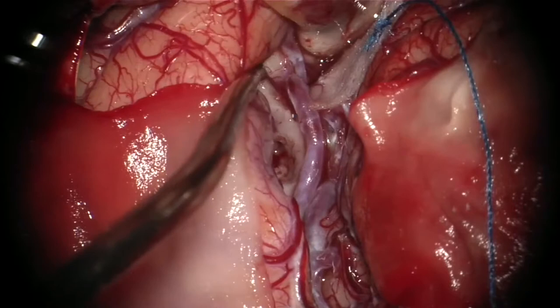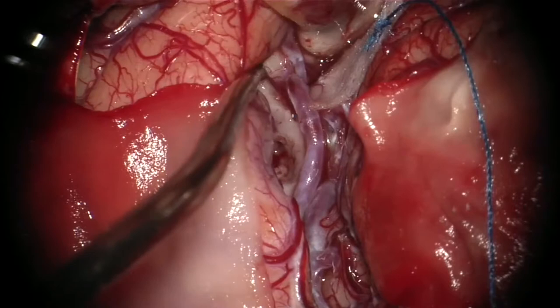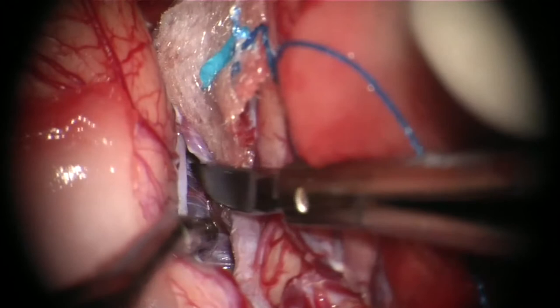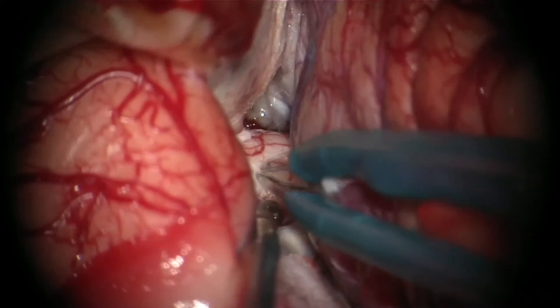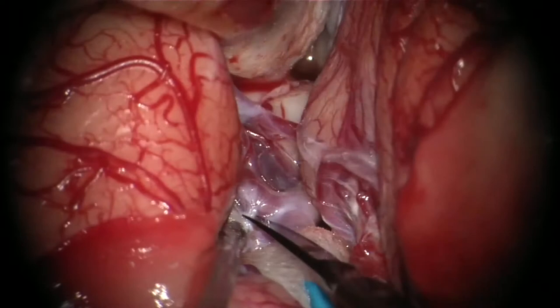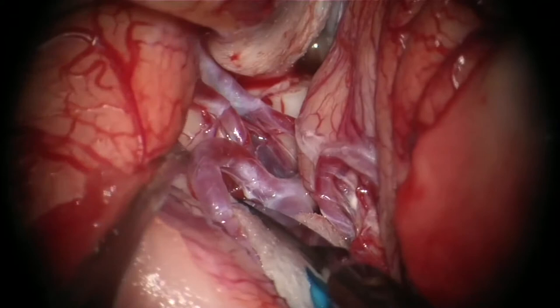These are the first pieces that we take for biopsy. And you can see here nicely the location of the anterior aspect of the uncus. I have to continue dissecting these MCA branches. I want to identify the lenticulostriates which go to the anterior perforated substance. This is a key landmark of the approach because it's the superior limit of the resection. Now I can coagulate the anterior aspect of the uncus and keep mobilizing these early temporal branches from the inferior trunk of the MCA.